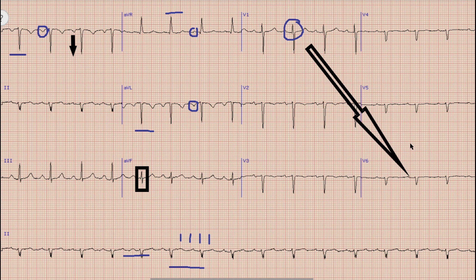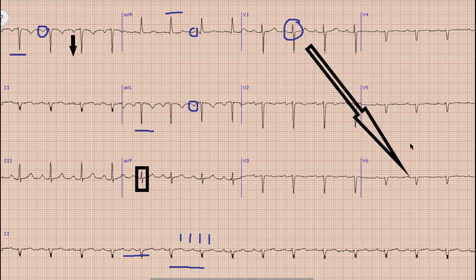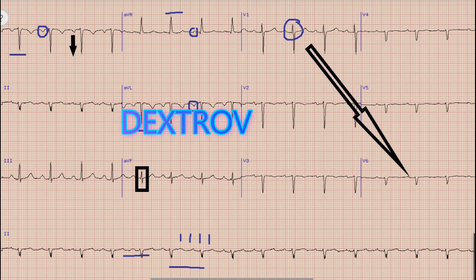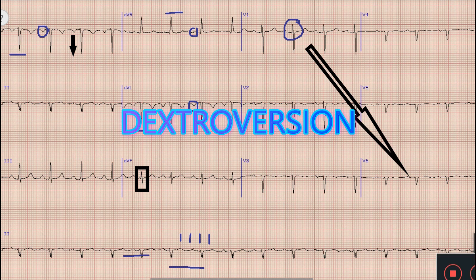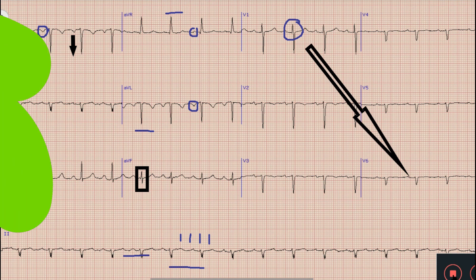This means there is dextrocardia. In dextrocardia, the heart lies on the right side of the chest, and the left atrium and left ventricle lie on the right side of the RV and RA. A related condition is dextroversion, where the heart lies on the right side of the chest but the LA and LV are present on the left side of the RA and RV.